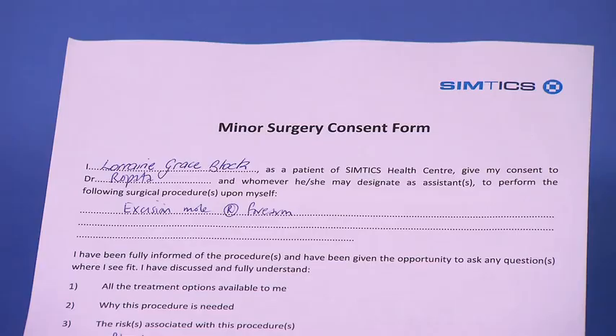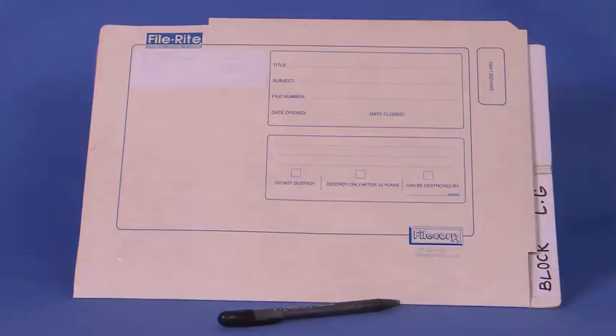A completed consent form, the patient's medical record, and a pen.